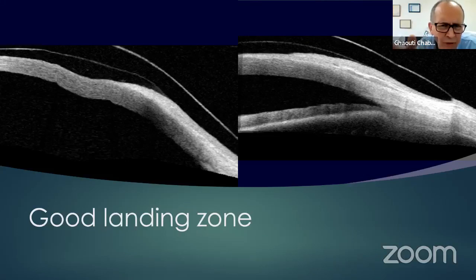14.9 or 15, well, those are small lenses, but you're probably going to hit the limbal area. So the lenses I design are usually 15.6 or larger. And sometimes you think of it like this: if you have a big house, you need a big roof. So it all depends on what I'm dealing with.